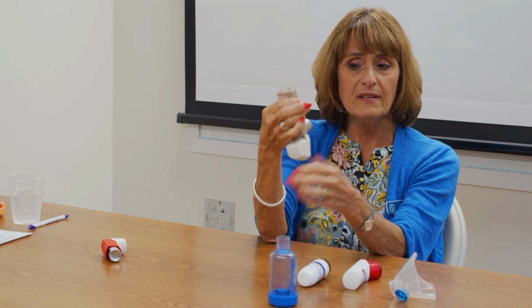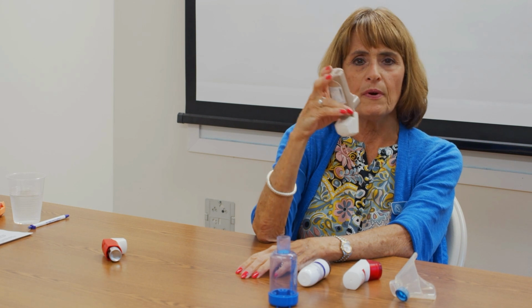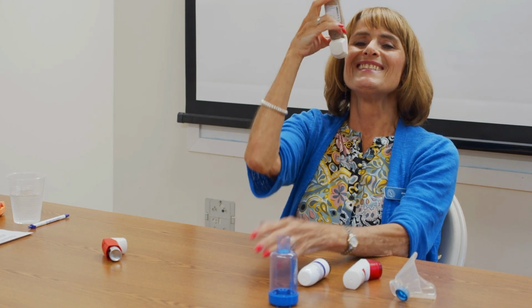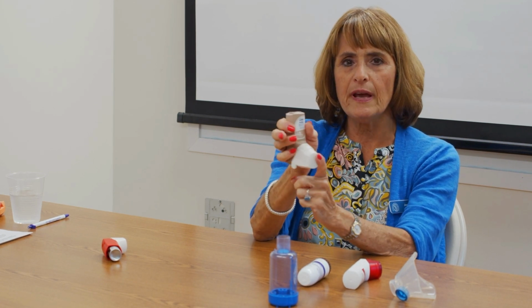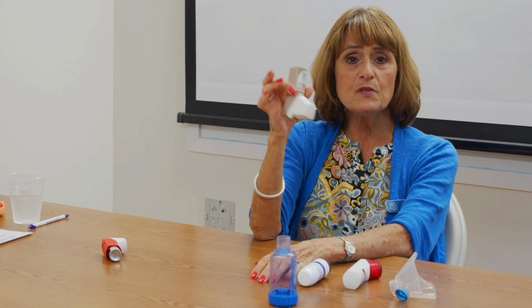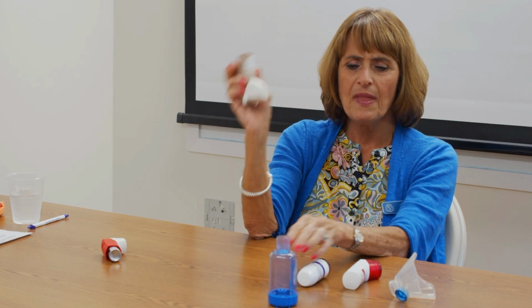So you're gonna do that, and then no shaking, no priming. Put the inhaler in your mouth, deep breath in for 10 seconds, and close the cap. Before you do the next dose, same thing, close the cap. You have to remember to do that in between the doses to load it. So this is really easy to use. It may be good for older children to use these.